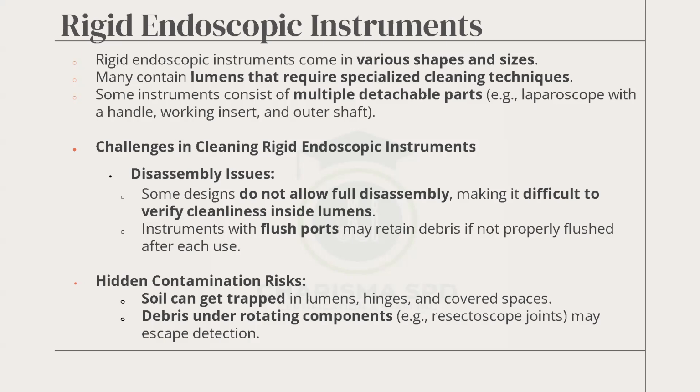Debris under rotating components: the parts of the endoscope that rotate, we have manipulating devices or levers, some mechanisms on the endoscopes that the surgeon regulates, either rotating or pressing down or pressing up, just like the foot pedal. Those that the surgeon uses his hand to operate whilst his hand is bloody, all of those areas have to be properly inspected for bioburden and cracks so that you can clean them to make them ready for use.